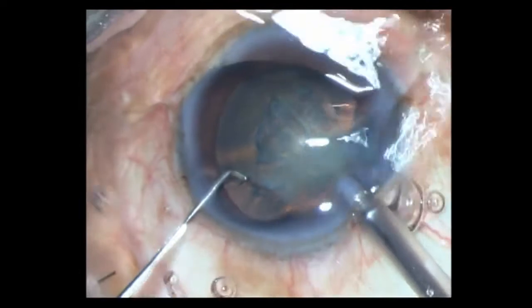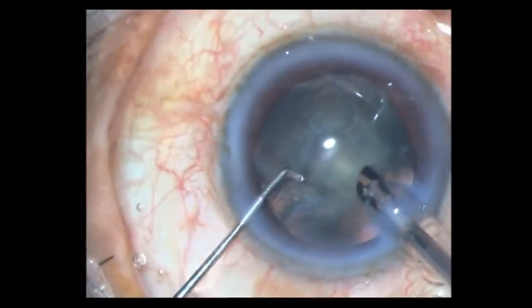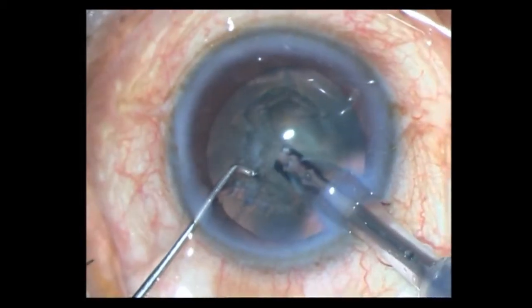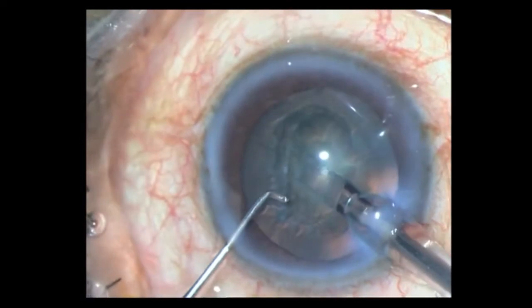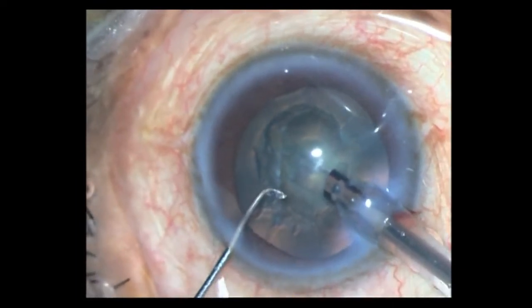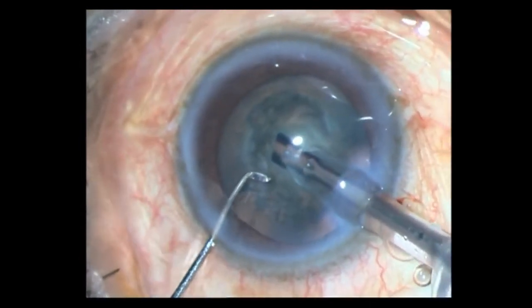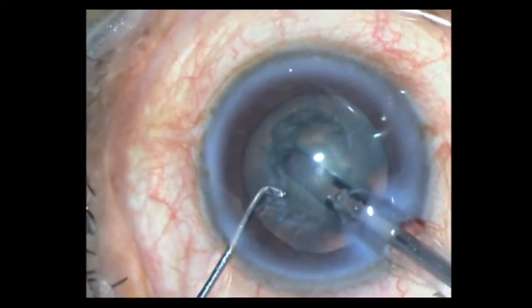I then fill the chamber with HPMC and take a blunt chopper in my left hand, with my 2.2 phaco tip in my right. I aspirate some of the superficial cortex and I'm in my sculpting parameters: approximately 100mm vacuum, 18 to 20ml flow rate, and around 50% ultrasound — though of course I'm not using that much. Just making the initial trench; even the 100mm vacuum seems to be grabbing the nucleus.